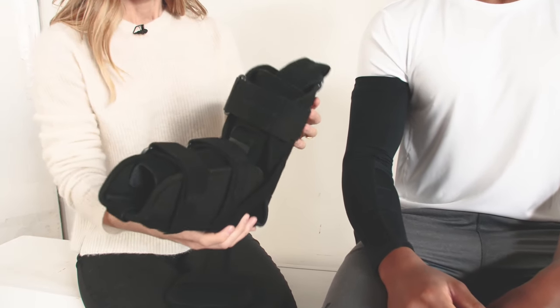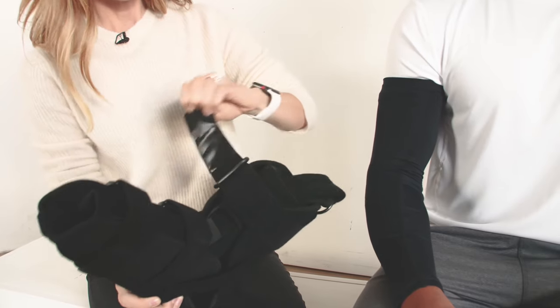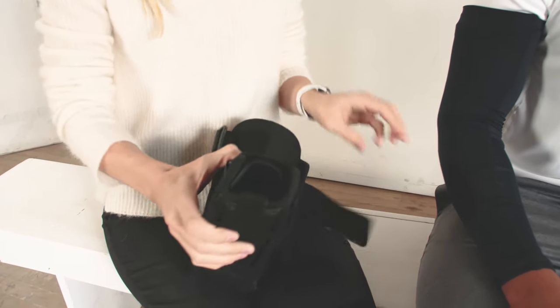In order to apply you're going to have to deconstruct the brace to some degree. I'm going to open all of the straps so that I can get it prepared to insert his arm.